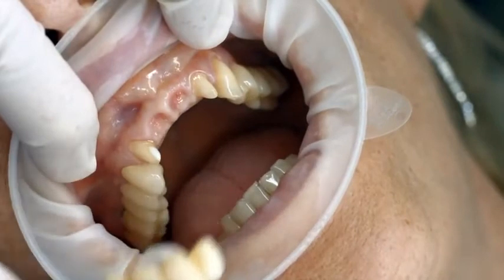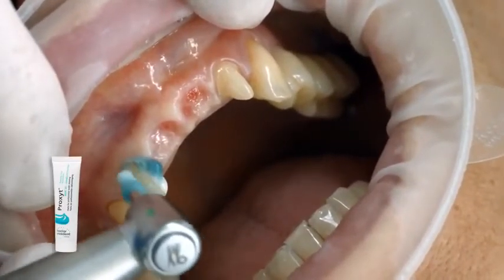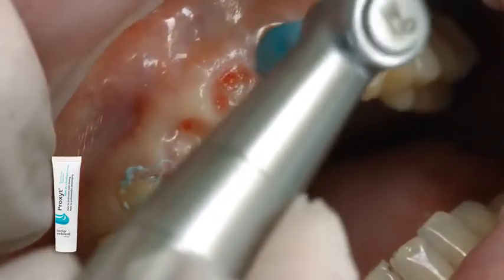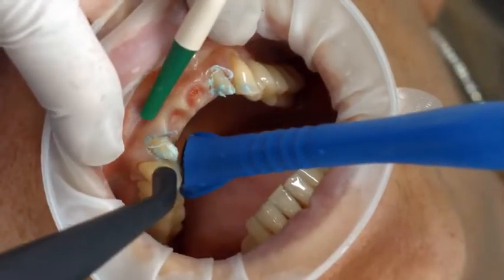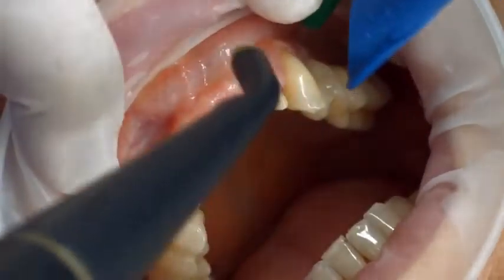Remove the temporary. Remove possible residue of the temporary luting material with a polishing brush and an oil and fluoride-free cleaning paste, such as the fluoride-free Proxite. Subsequently, rinse the cavity or preparation with water spray and dry it with water and oil-free air.